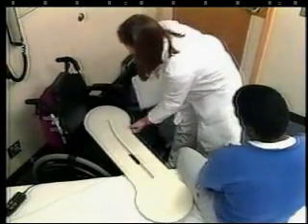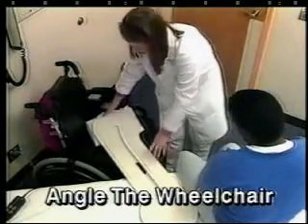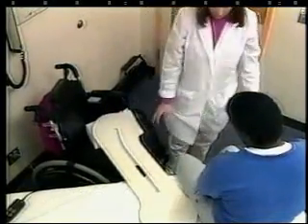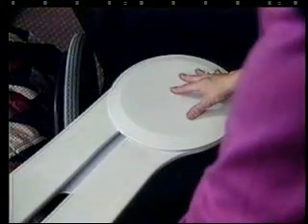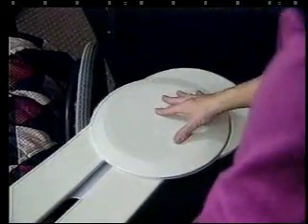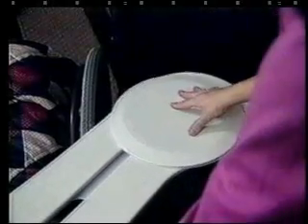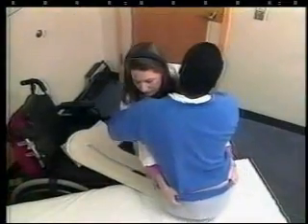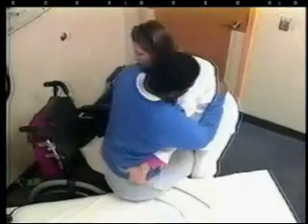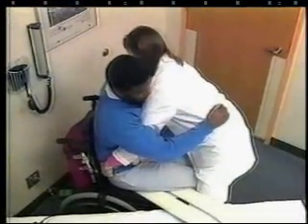Once the transfer is made as level as possible, you'll want to look at the angle at which the chair is placed. You may want to make a dry run, making sure that the seat will not contact a wheelchair wheel or anything else while the patient is on it. You should move the patient to their final position in one easy motion. The proper chair angle will also help you avoid obstacles.